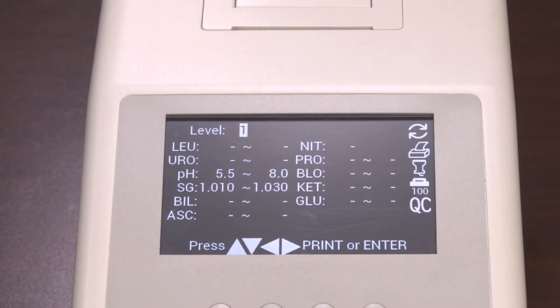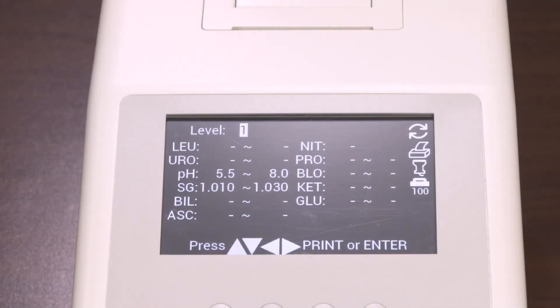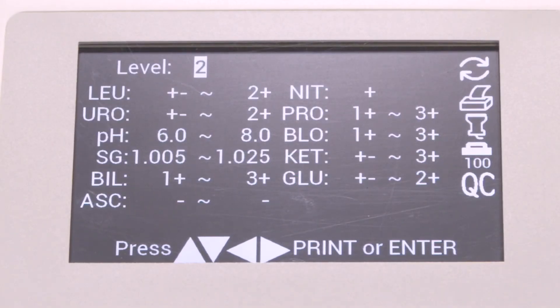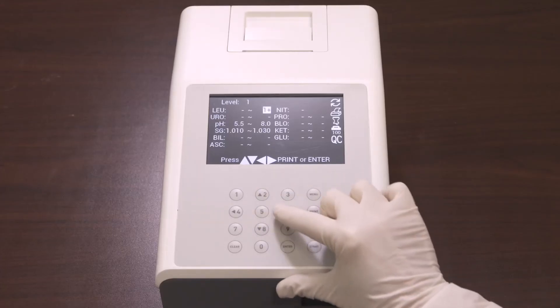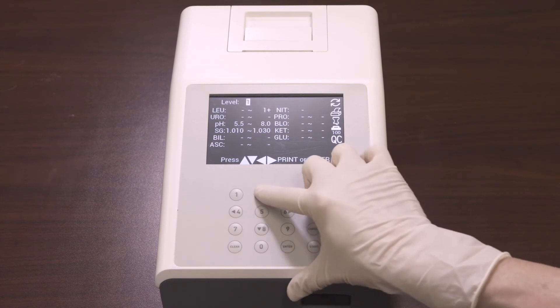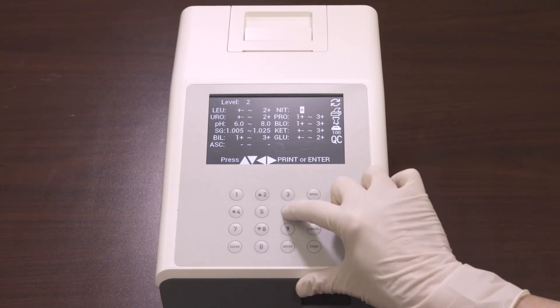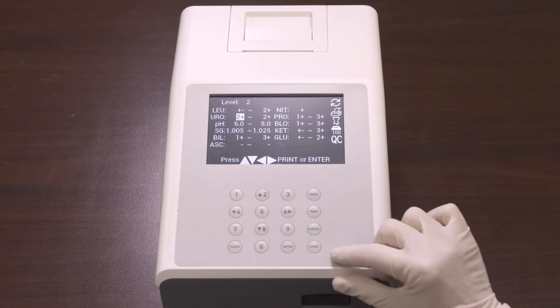This screen only recognizes arbitrary values. The values are located on the package insert that comes with your liquid controls. When the cursor is on level number one or two, press the up or down arrow to navigate between the level one and level two value screens. Press the left or right arrow to move to the digit to be changed, and press up or down arrow to increase or decrease the value. Change each of the analyte QC values in this manner until the values on the screen match the values on the expected values insert. Once you input the QC values, press Enter to save the changes and exit the screen, or press Print to print the current values.